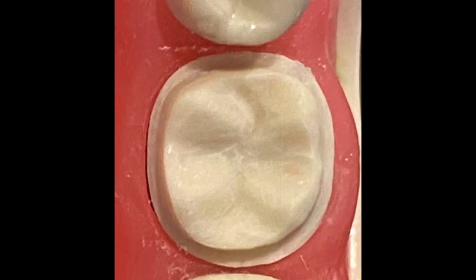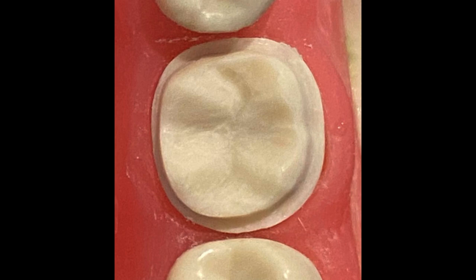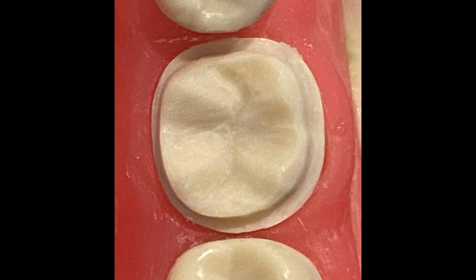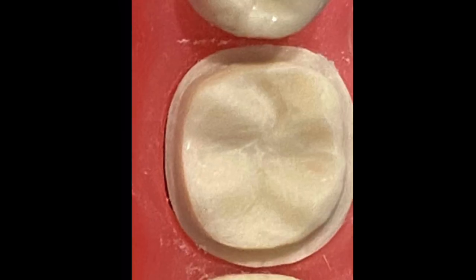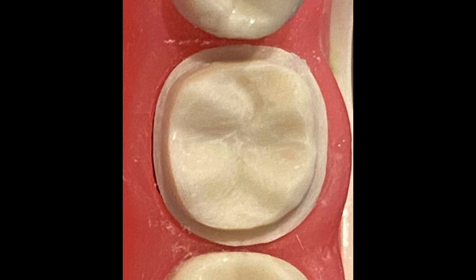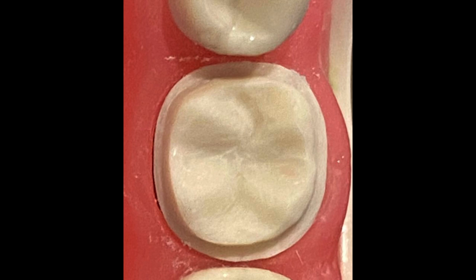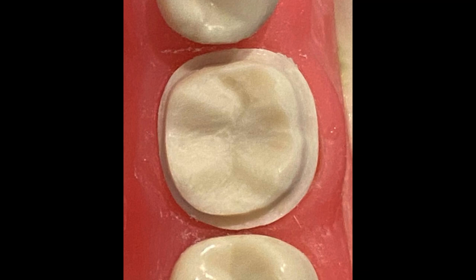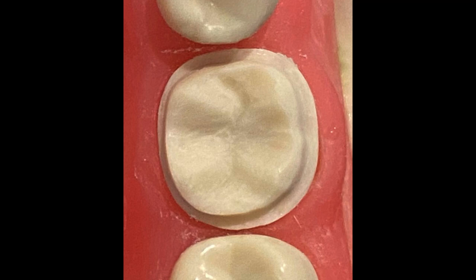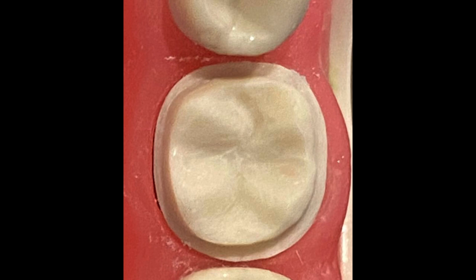As soon as you tilt it to 15 degrees, now you can see the full palatal margin. That's how it should be. So if it's less visible from the occlusal view, it's a good sign. As soon as you tilt it, then you should see it complete. When you start to see the full margin from an occlusal view without any tilt — in a straight line axis — please double check it; you might have over-reduced it. This is a very important concept for the 46 and 36 because of the palatal inclination. If you don't see much of the palatal or a very clean margin, it's a good sign — it's not an undercut, it's a good clinically refined prep. As soon as you tilt it to the true straight line axis, that slight tilt is when you see the whole margin.